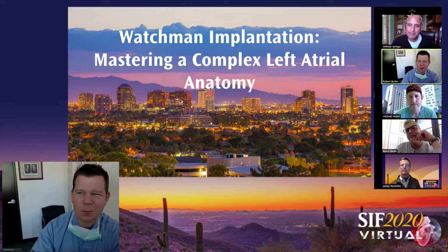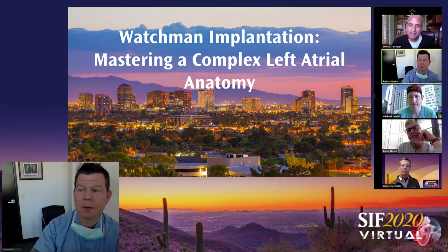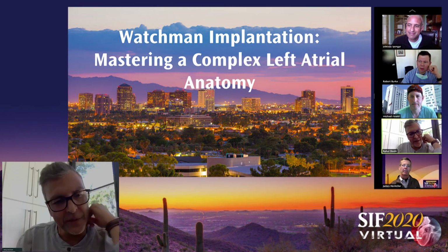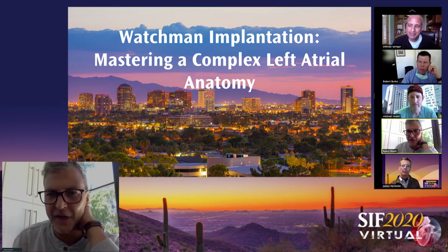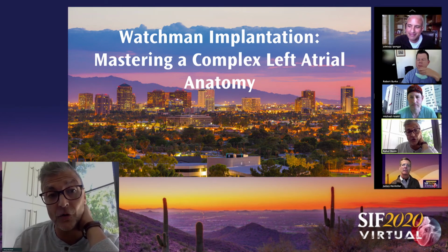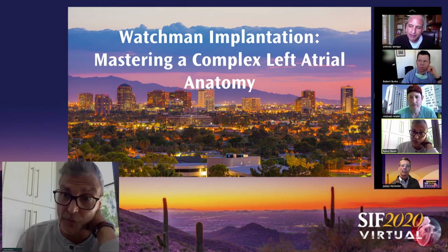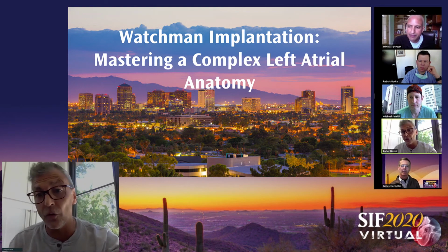But I think we owe it to them to do a screen, unless you're going to be taking people off, maybe a couple of times a year, just because they do have a thrombus. There's going to be a balance there, I suppose. I would actually make the point, coming from the EP side of things, that we have moved to uninterrupted anticoagulation for all these procedures, and you just don't see thrombus. As compared to interrupting NOAC therapy, which is a higher likelihood of thrombus formation than interrupting Coumadin therapy. I don't think there's any doubt about that, and we've seen this over and over and over again.